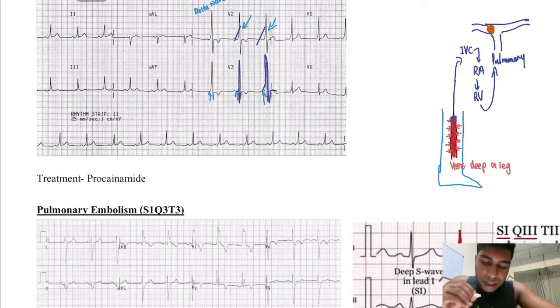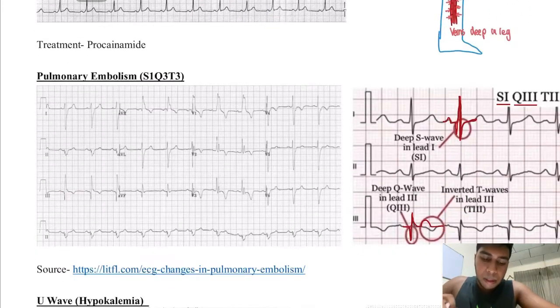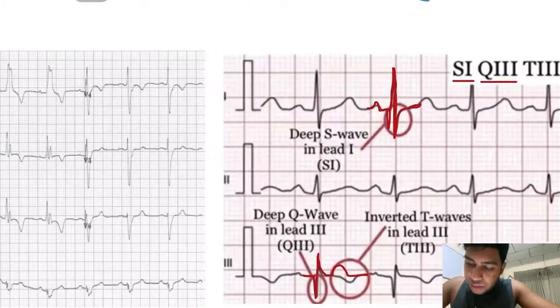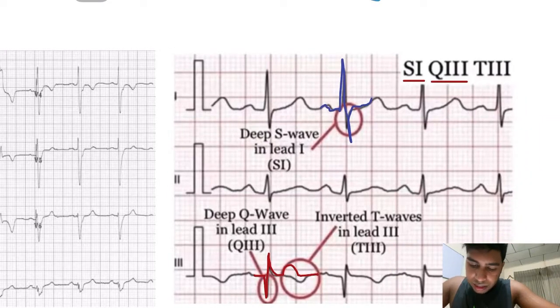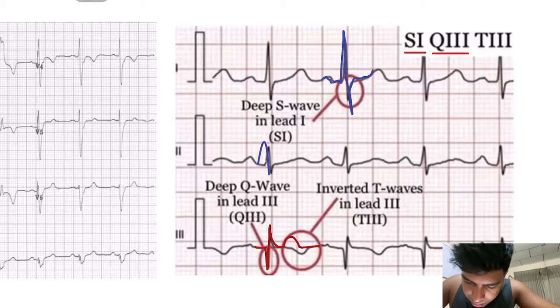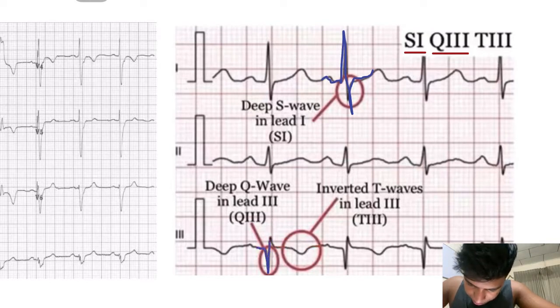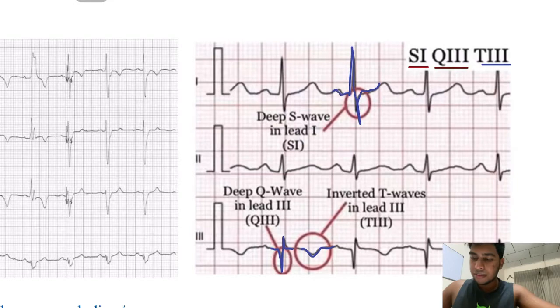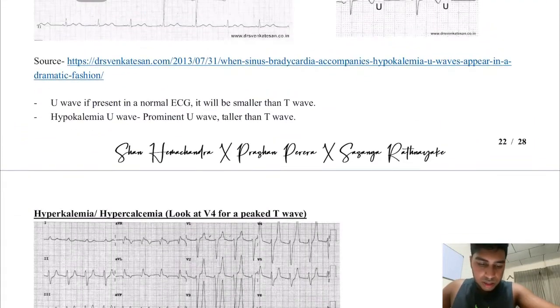The treatment for Wolf-Parkinson-White is procainamide. Next, pulmonary embolism: the ECG changes are S1, Q3, and T3. S1 means the S wave in lead one will be deep; Q3 means a deep Q wave in lead three — you can see the deep Q wave here; and T3 means inverted T waves in lead three, so instead of going the same direction as the R wave, the T wave is inverted.